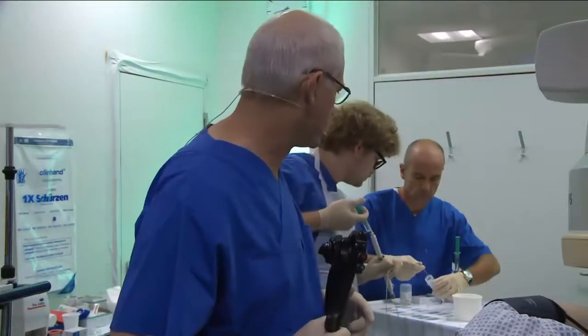Whereas we used to do only quick preps on the slides, we're now doing cell blocks on every case. We're going after histology in many cases, and so the preparation of the specimen has changed a little bit.